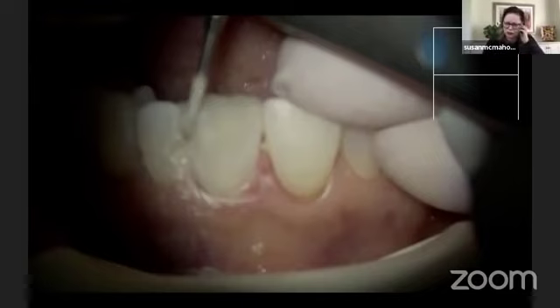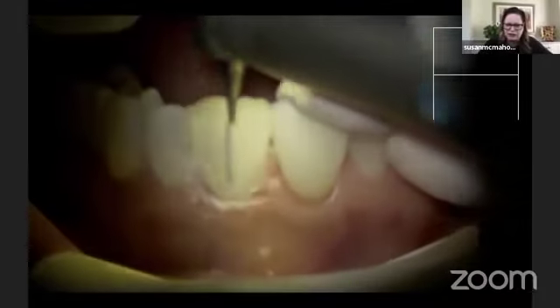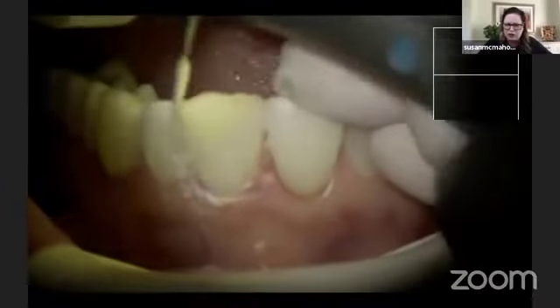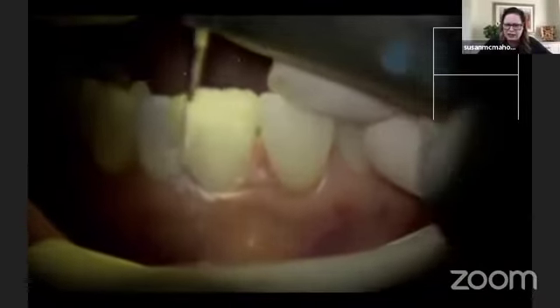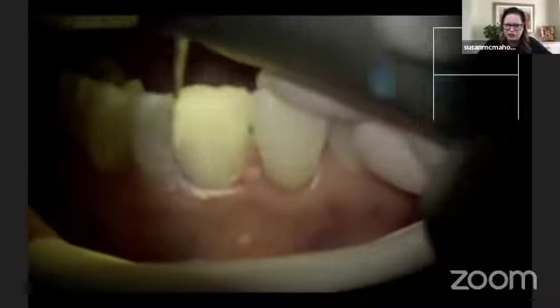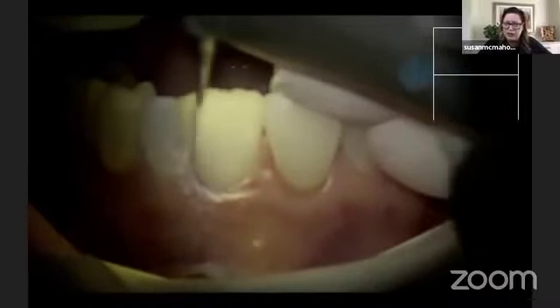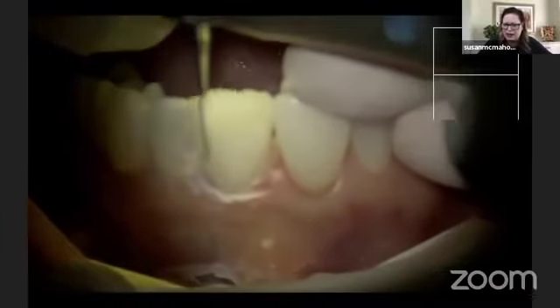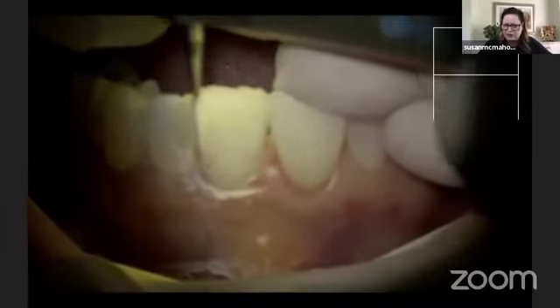Then you take that coarse diamond again, and we're going to get the whole rest of the anatomy in just a minute or two. I'm going to take that coarse diamond and go over all the composite and get the shape. I'm going to round out those corners just a hair because I don't want them to be 90 degrees. I want them to be slightly rounded. So the whole composite first, and then I'm putting the lobes in.